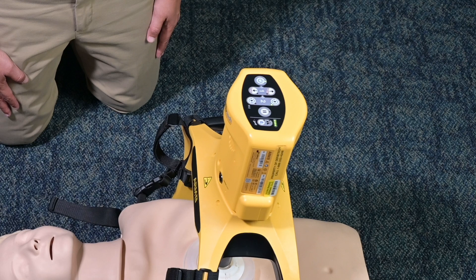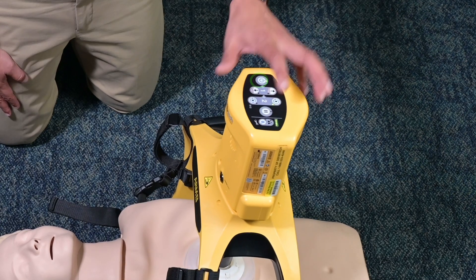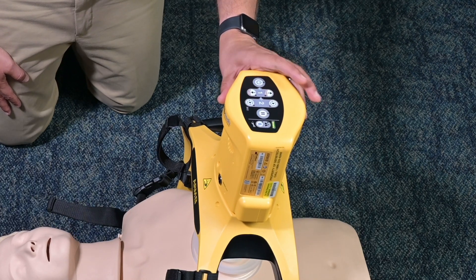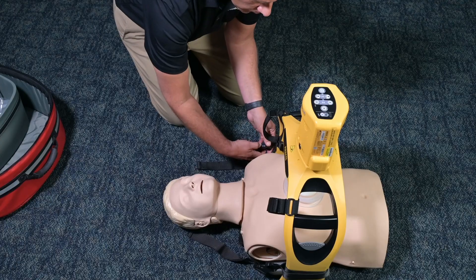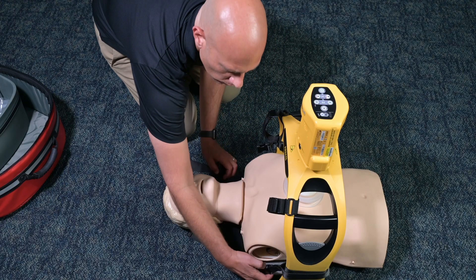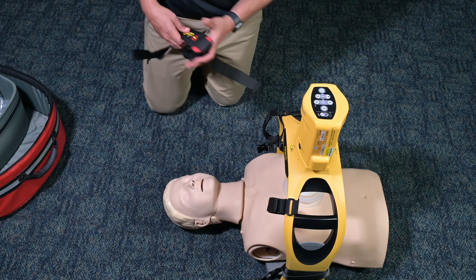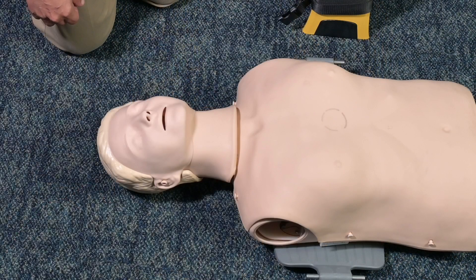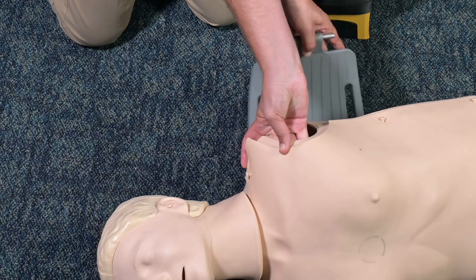When removing the ArmXR from a patient, make sure to turn the unit off. Remove the wrist straps and stabilization strap. Then use the latch release levers to release the frame from the backboard. At this point, the backboard can be removed from underneath the patient.